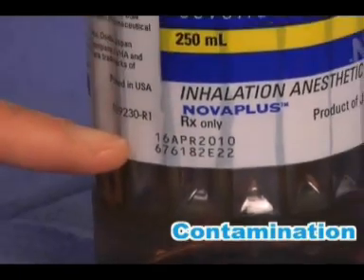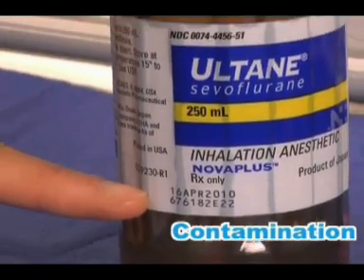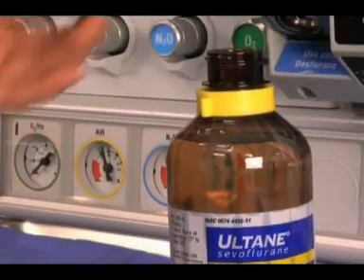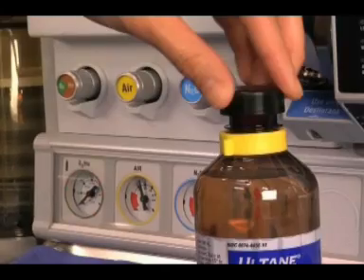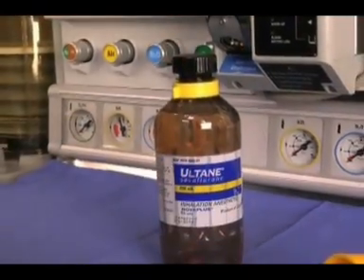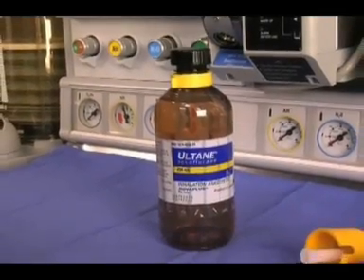Contamination. Using a contaminated bottle of anesthetic agent can potentially harm a patient. An acidic odor can sometimes be noted, and the agent should be disposed of. After use, make sure that the agent is properly stored.